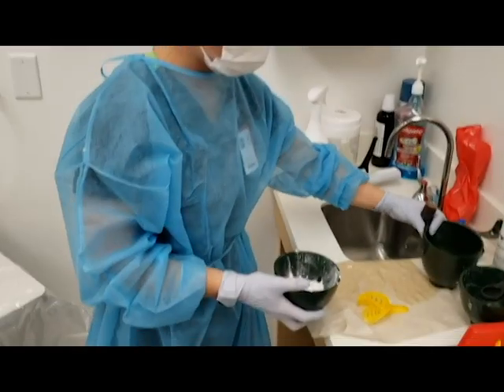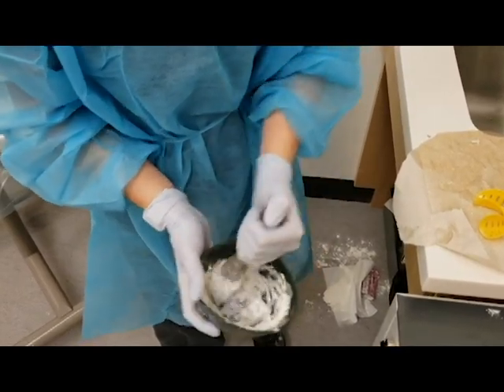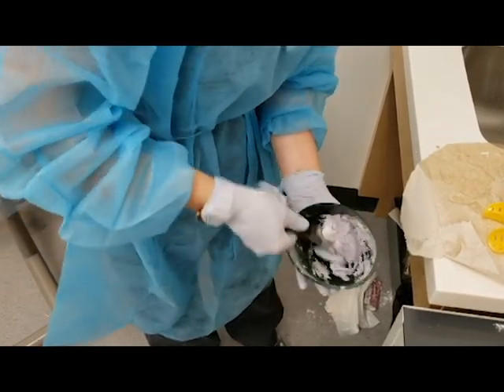Getting the water in again, getting a nice even mix — just like cake batter.